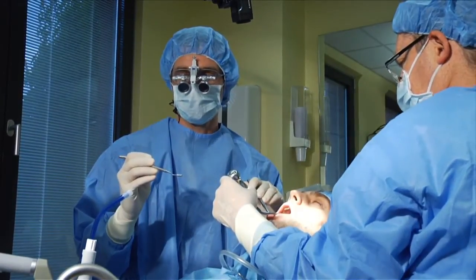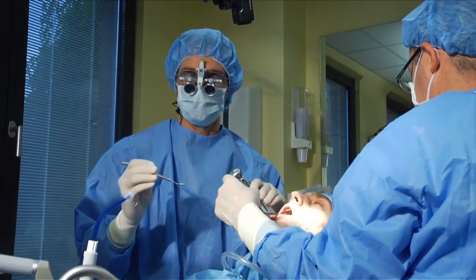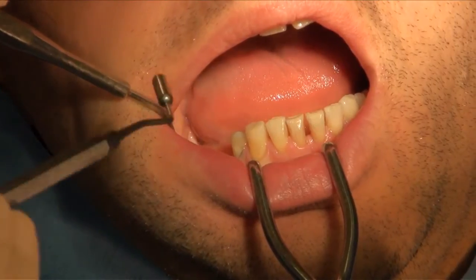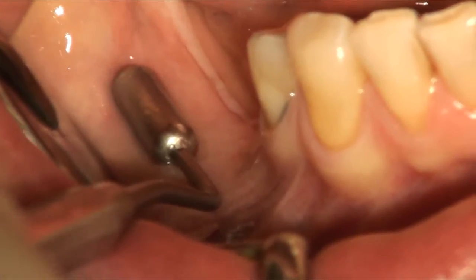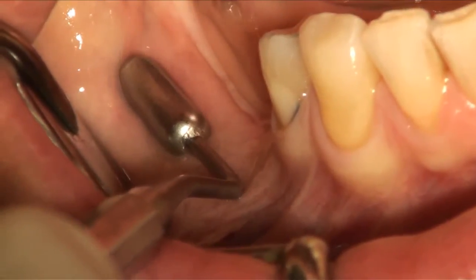This side of the template corresponds to the initial volume of the tissue expander. And with this side of the template, we plan the incision and the placement of the expander into the pouch.